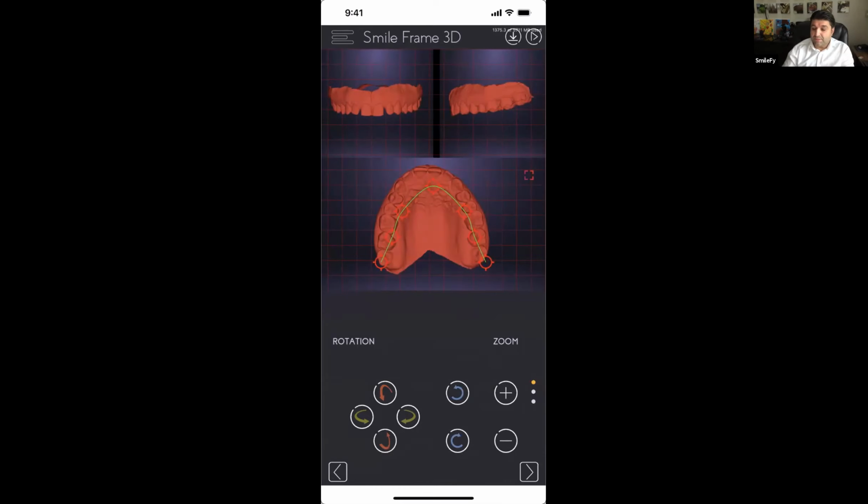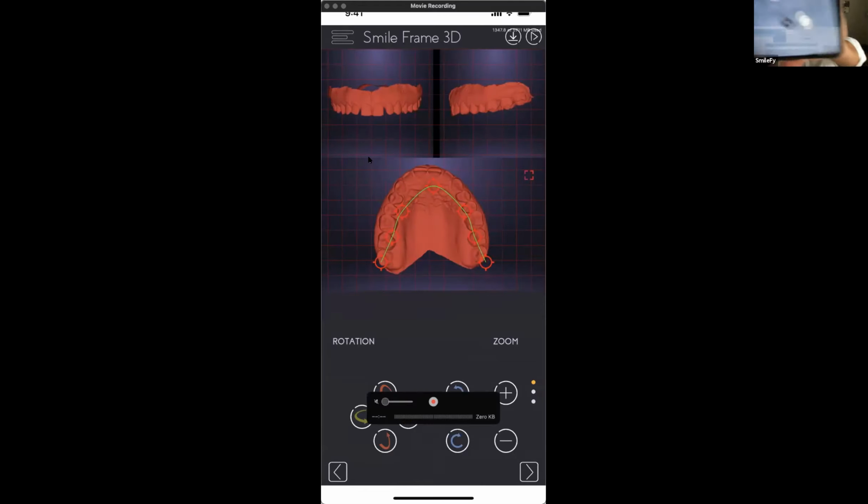because I'm a guy who develops all these features on mobile applications, I need to... here. Okay, here I need to adjust the AC from my phone because it's getting hot.